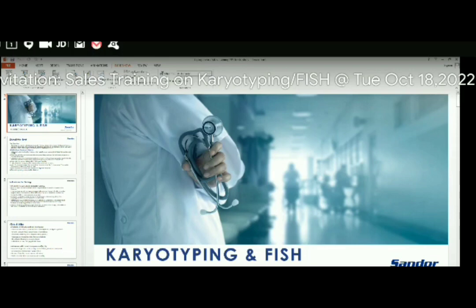First thing, this is very important. And then next, after getting samples, how we have to collect the samples is again a very important criterion. When compared to other departments, where they can have a sample with antibiotics also without any issues, for cytogenetics you must have thorough knowledge that before taking a sample itself, you have to take care that the patient should not be on any kind of antibiotics for a period of 1 week before giving the sample.